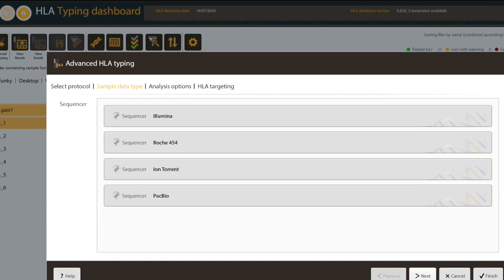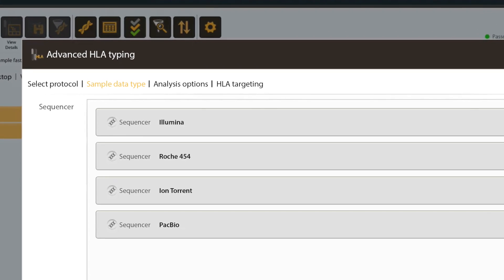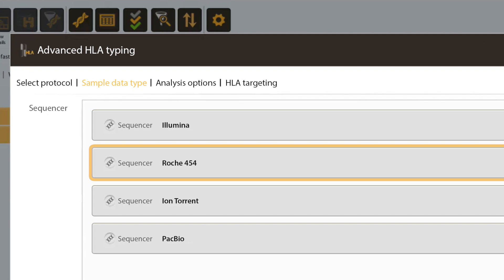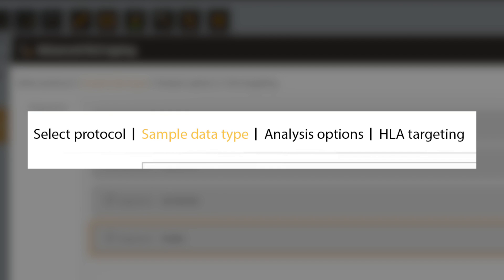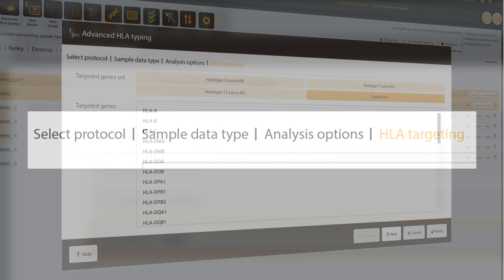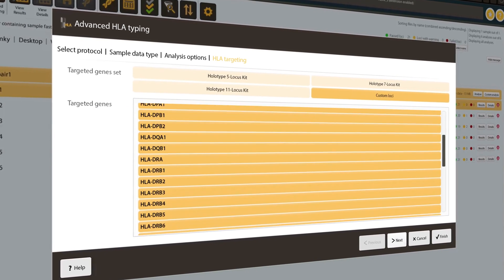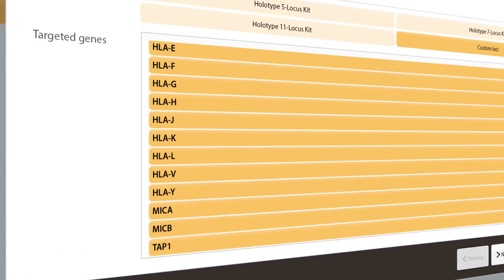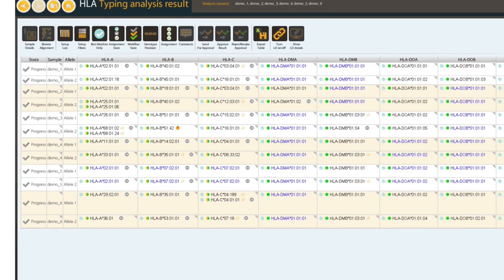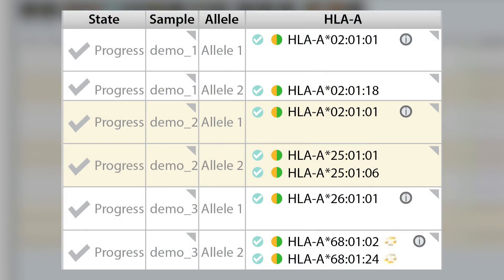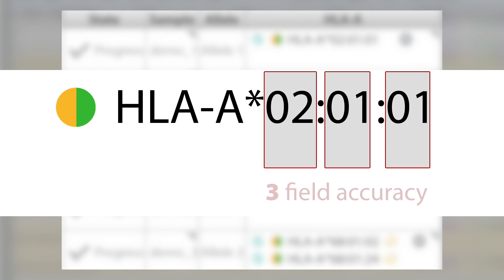The base module of HLA-Explore analyses Illumina or ion-torrent S5 data from any targeted genotyping assay, including all classical loci and non-classical loci such as MIC-A, MIC-B, TAP-1 or TAP-2. Assuming the appropriate locus capture method, all loci are analysed to three-field accuracy and assign the best matching allele name using IMGT HLA.